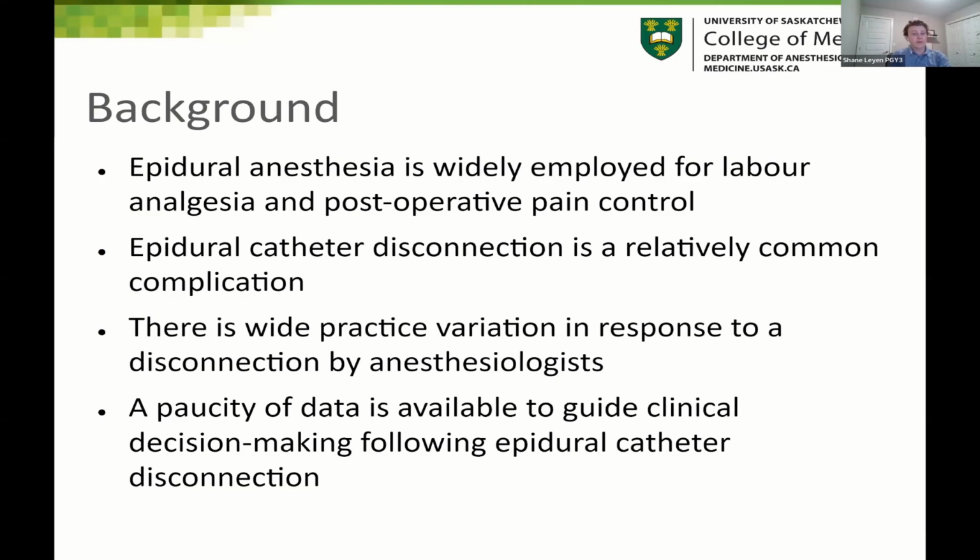So for a little bit of background, epidural anesthesia, as we all know, is widely employed for labor analgesia and postoperative pain control. Epidural catheter disconnection is a relatively common complication, and there's quite a wide practice variation in response to disconnection by anesthesiologists everywhere. And there is a paucity of data available to guide clinical decision-making following these epidural catheter disconnections.